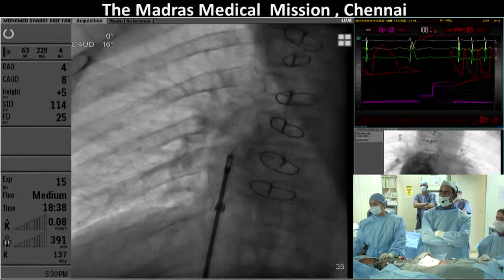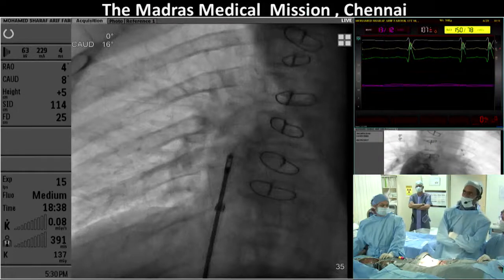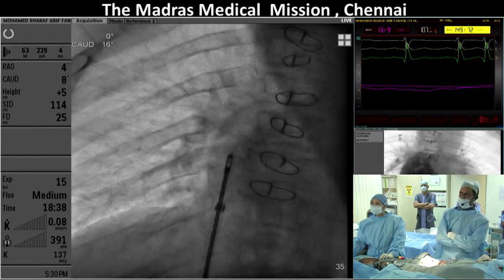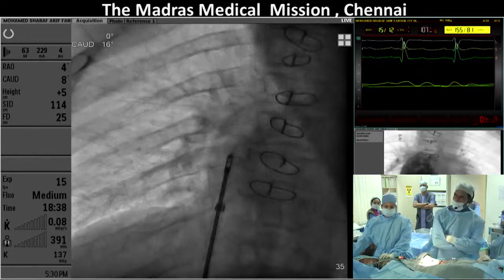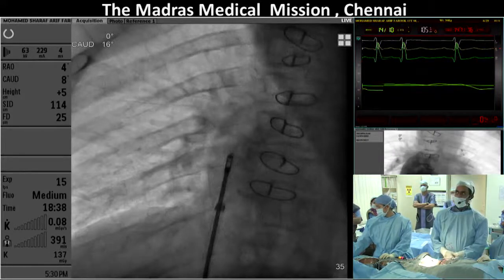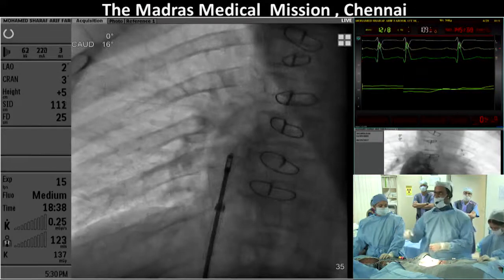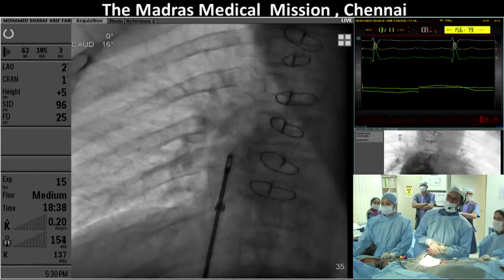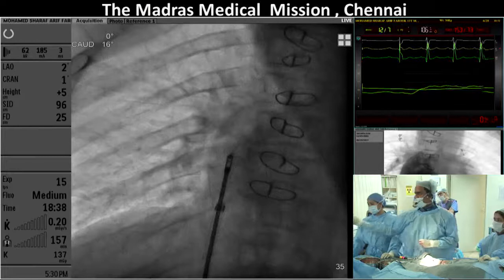What pressure were you getting in the baffle? I can't see. The values are around 13 millimeters of mercury. The Fontan pressures. What is it now? What are the Fontan pressures reading now that you have the device deployed but not released? Not released, and now we are having not much of elevation. It's somewhere around 13, 12 to 13. It's between the 10 and the 15 lines. Zero it once again, properly zero.